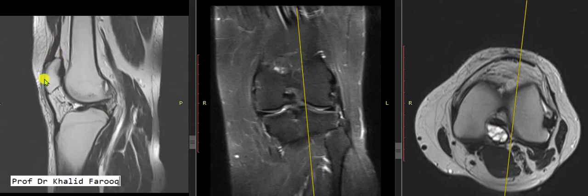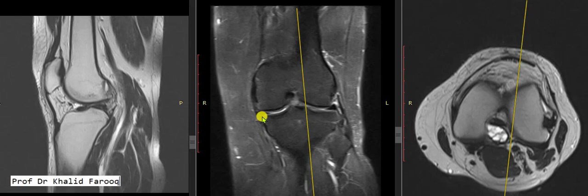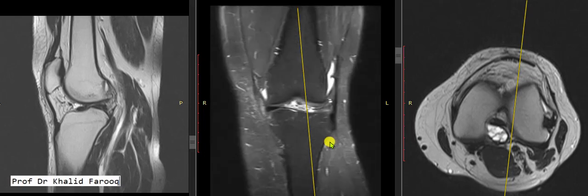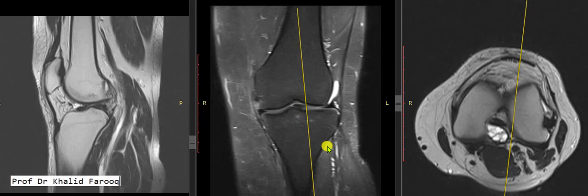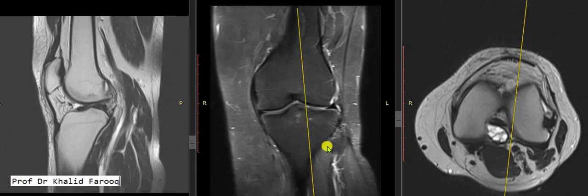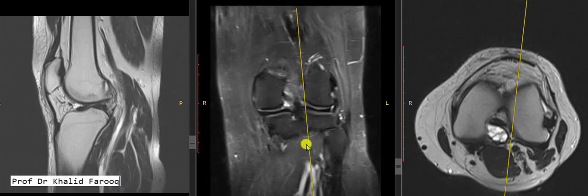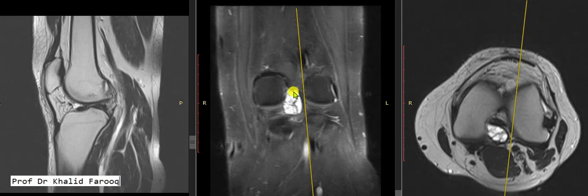There is mild posterior bulge of the posterior capsule of the knee. Overall, the quadriceps and patellar tendons appear normal. The infrapatellar Hoffa's fat pad is unremarkable. The medial and lateral menisci appear unremarkable — both menisci show normal signal and morphology. Collateral ligaments are normal as well.